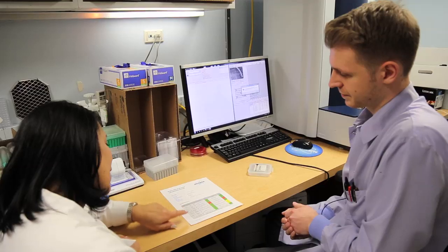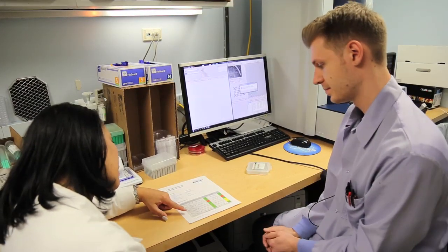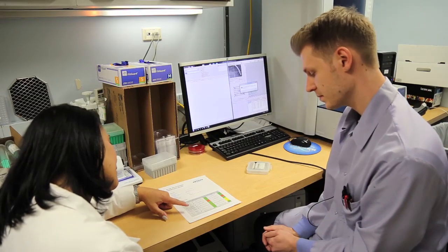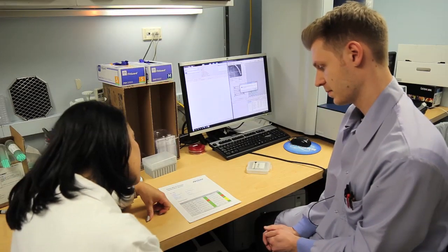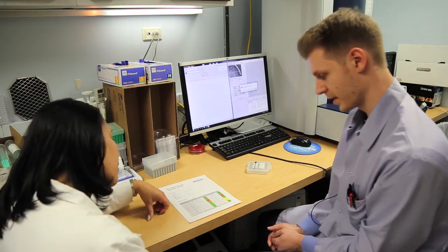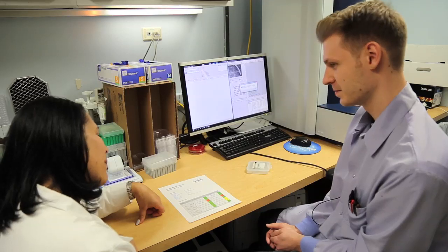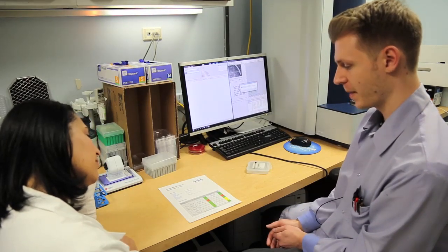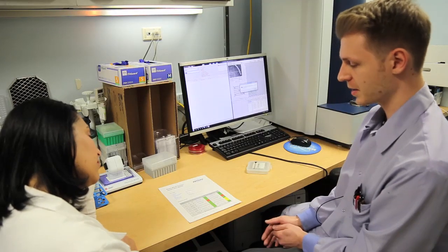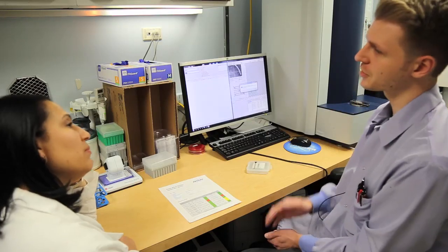Exactly. Okay, and then down here, this one has Staphylococcus hemolyticus, and that's a 2.13, but then right next to it is Staphylococcus, what is that? That's hemolyticus as well. The contacts aren't working very well, but it's 1.94 and it's yellow, so what does that mean? So it just means that our top score matched as hemolyticus, and the next closest thing in the database was also hemolyticus, but the score wasn't as good.